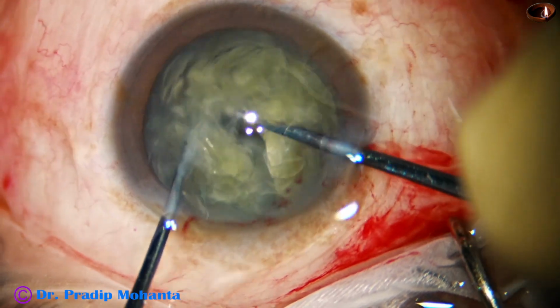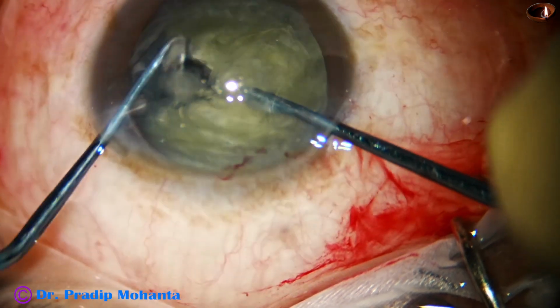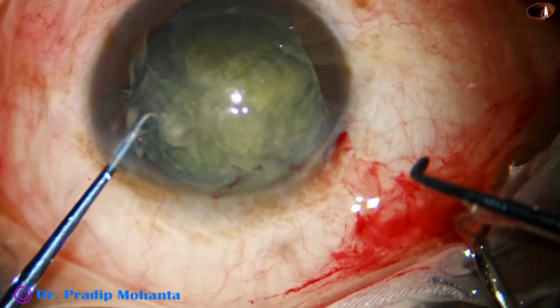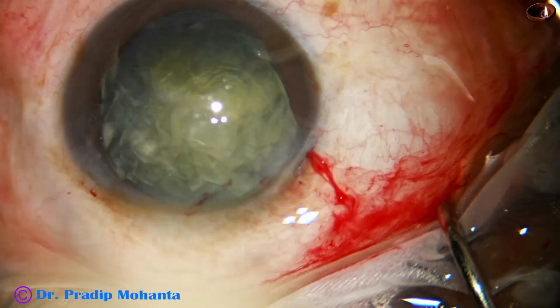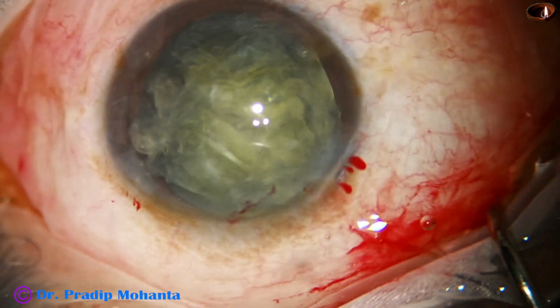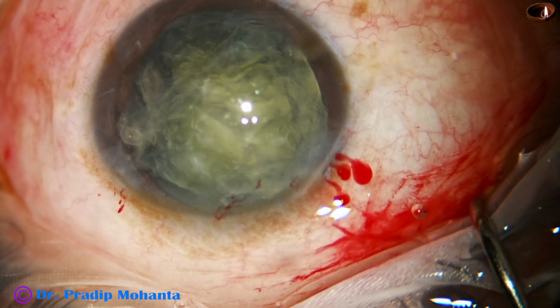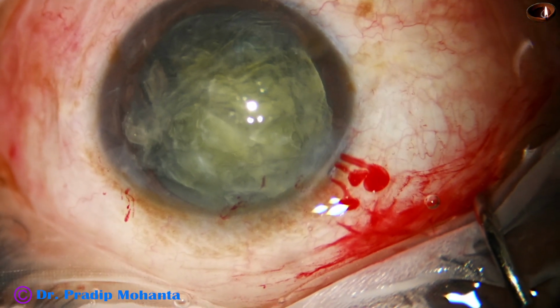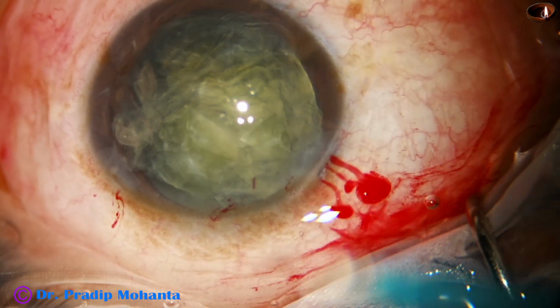And here one heminucleus has been divided into two pieces. The other heminucleus has not been divided. And now I come out, and now is the time to introduce the Phaco needle. Visco is used. The Phaco needle goes in with its bevel down.